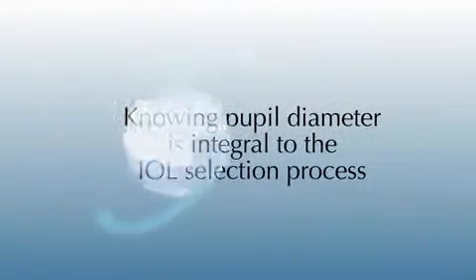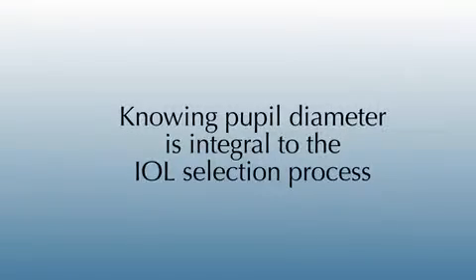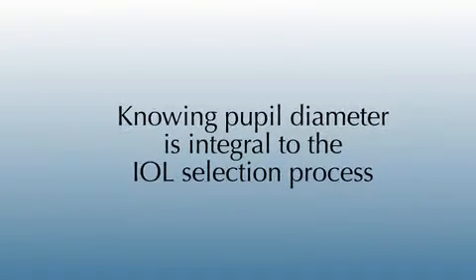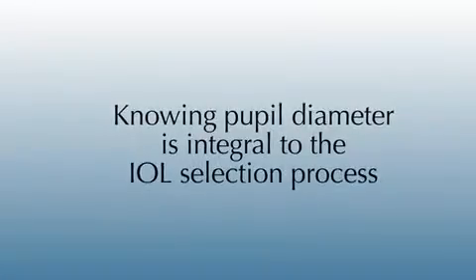Dr. Jeff Horn states that knowing pupil diameter is very important in IOL selection, and especially helpful in determining IOL selection for aspheric, accommodating, and diffractive multifocal IOLs. If you have a patient with a very large photopic pupil, I'll show you why the Restore may not work as well. And you need to know that.